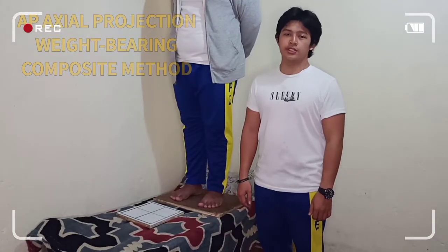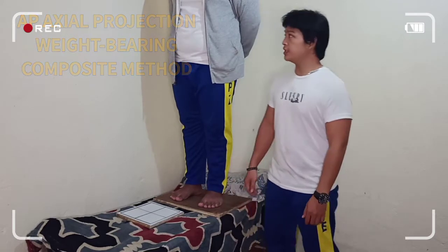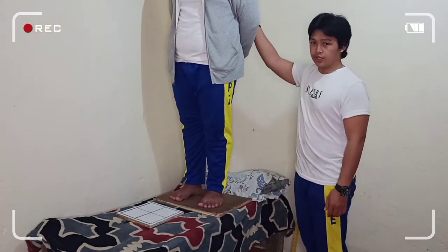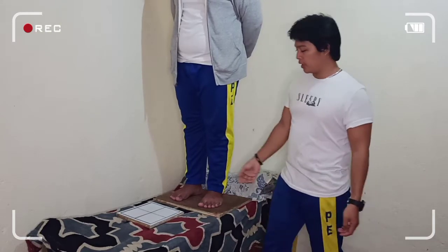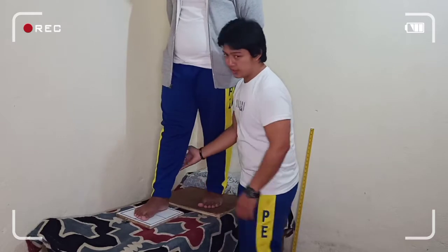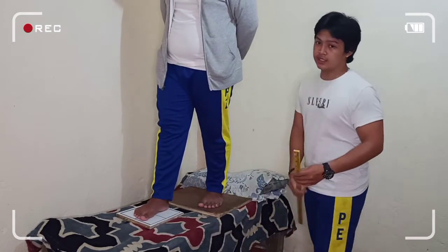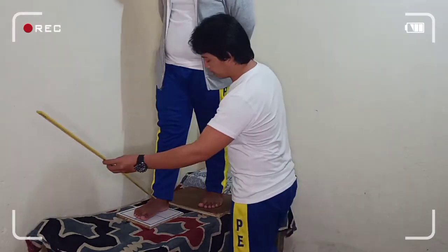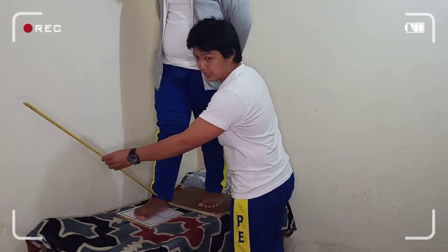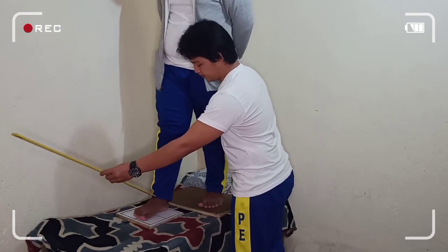The next projection is the AP axial weight-bearing composite method. Place the patient standing on the radiographic table with the affected foot placed forward and the other foot placed one step backward. For the first exposure, the central ray must be angled 15 degrees toward the heel at the base of the third metatarsal.